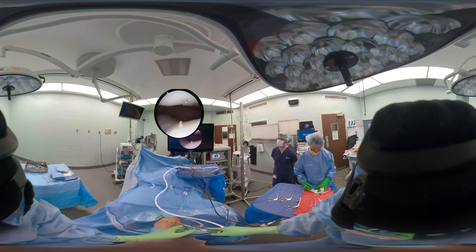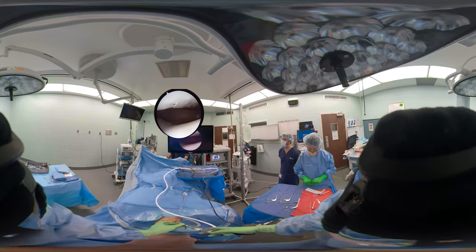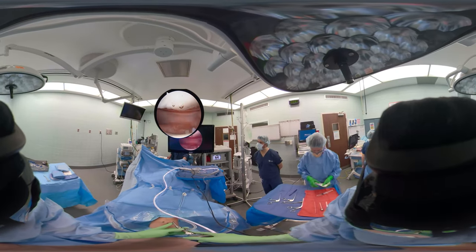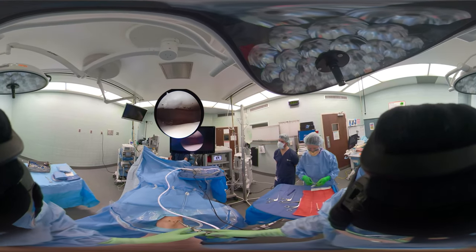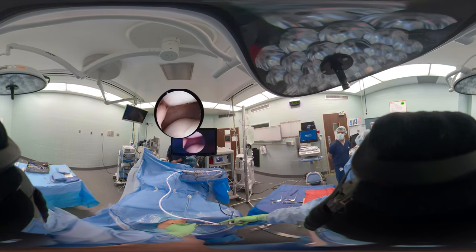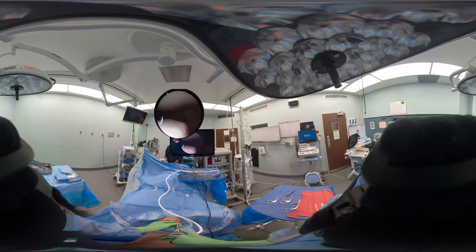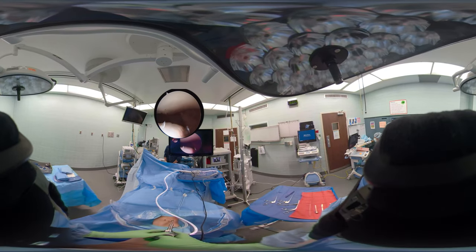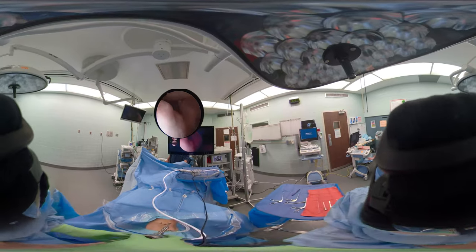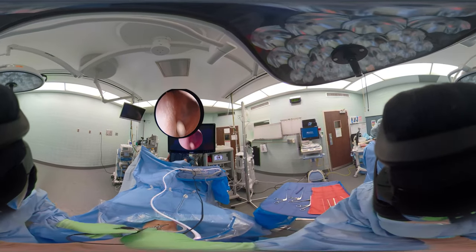Now you can see the undersurface of the patella and the trochlear groove. This patient has a loose body from a patellar dislocation that occurred three or four years previously and she could feel it pinging around. This is the patella and the trochlear groove. We knew from x-ray she had a loose body in the lateral gutter — and there it is, looking into the lateral gutter.